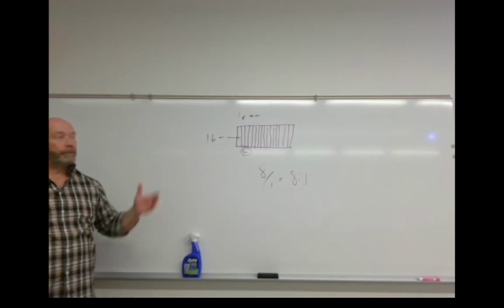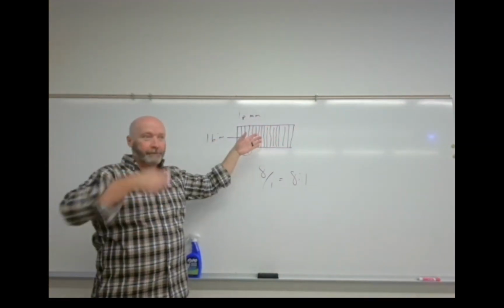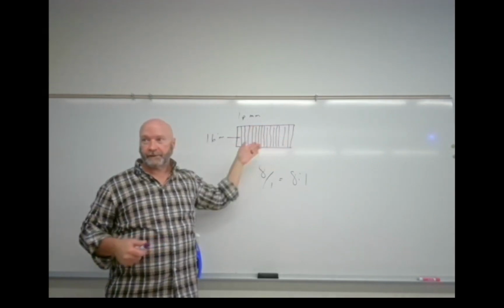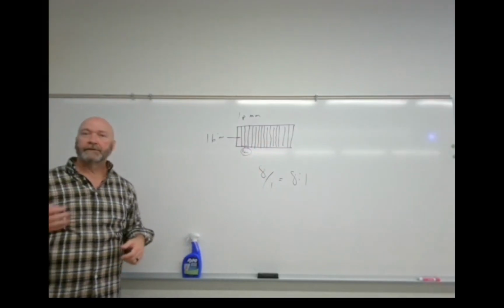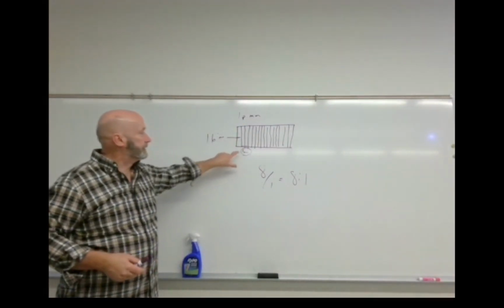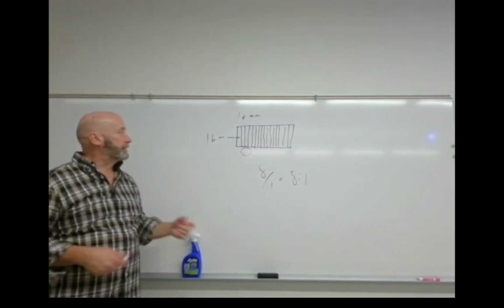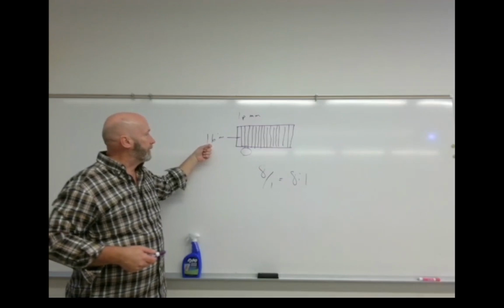Yeah. If you're familiar with what spackle is, spackle fills the cracks in a wall. So we spackled in the interspace with more lead strips. So I'll put more lead into the grid, same size grid. I just decreased the distance in between. Well, that's probably what's throwing you off. Yeah, I decreased the distance in between, and I doubled the amount of lead.